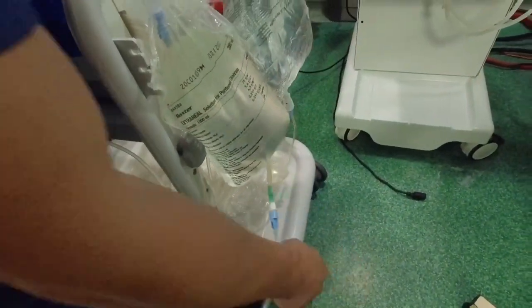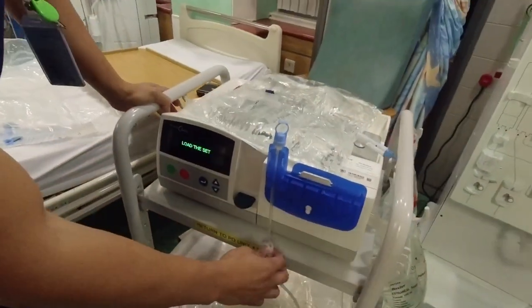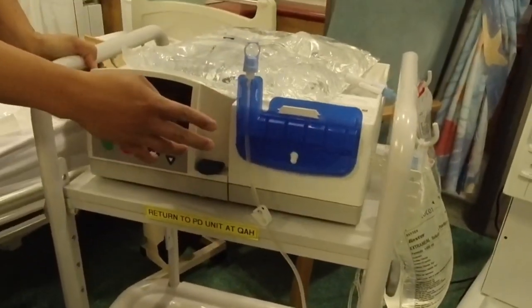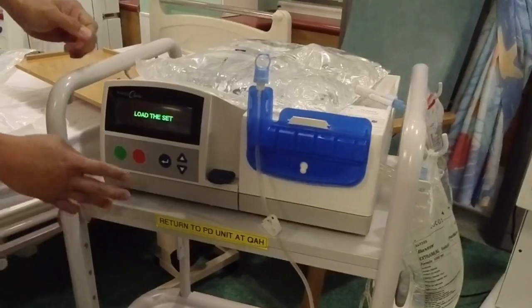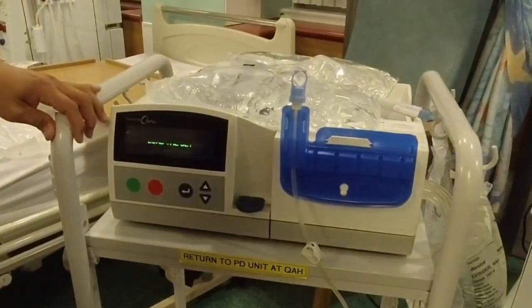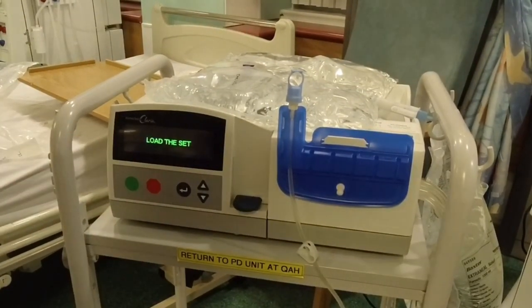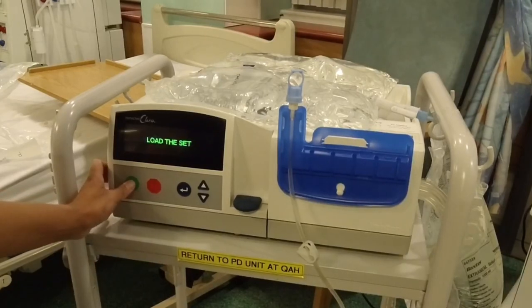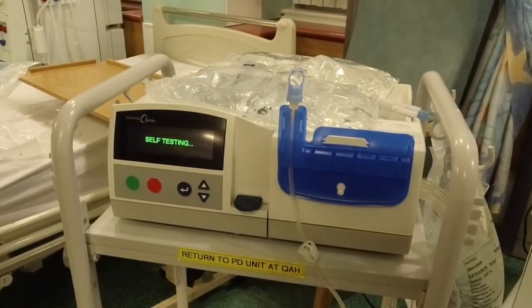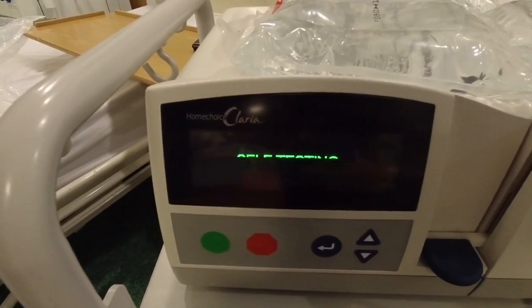Make sure all your clamps are open now. All the clamps are open. And that one is open too. Alright, this is the patient line. All clamps open. Yeah, apart from these two. Okay. Alright, the next one is, press the green button to load the set. Yeah. Self-testing. So it's doing its self-testing.